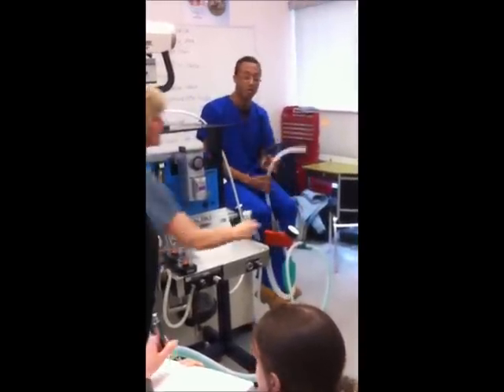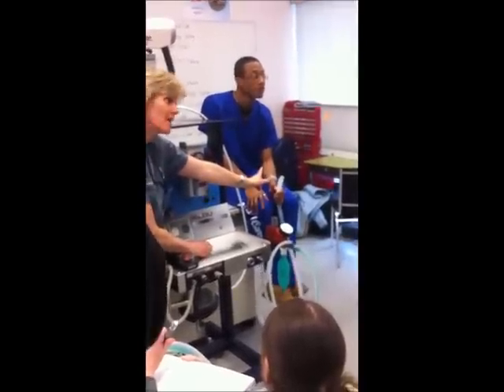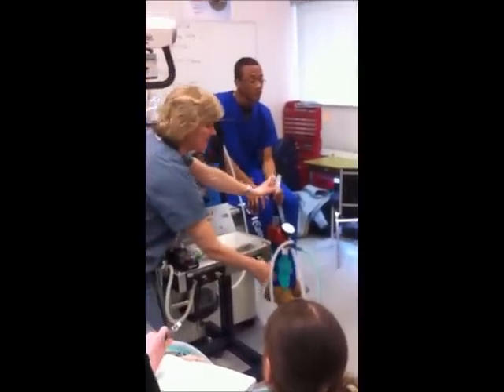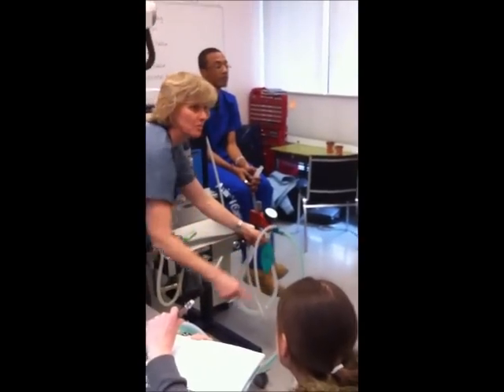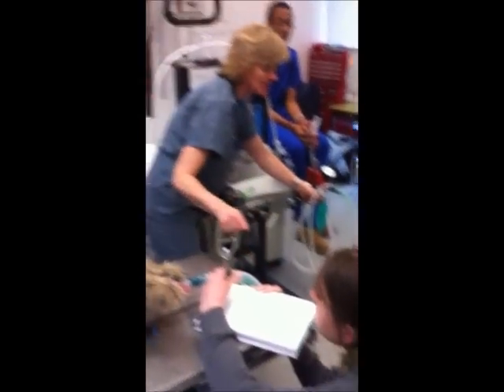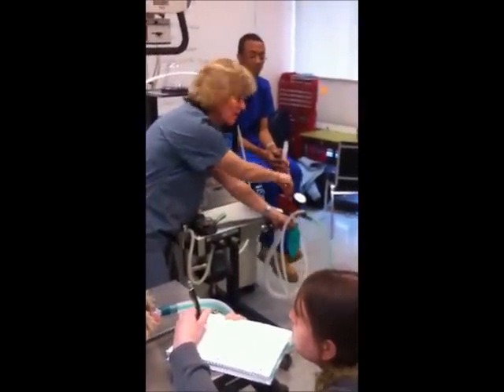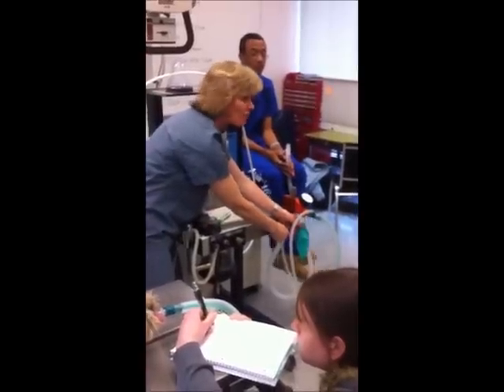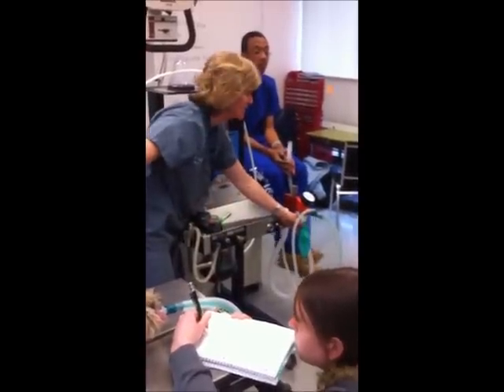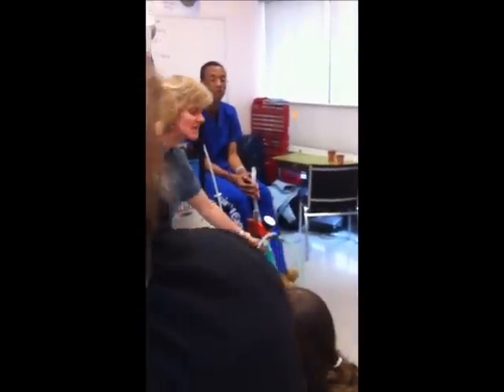Yeah, so if we've stopped flow going that way, I get my bag filling up, and really I would over time get pressure building up in my system here. I don't want that to happen. That's why we bag. It's active. So I close my pop-off valve. This will fill. Now at this point in time, it's filling with oxygen. I don't want anesthetic gas going into this animal's lungs at this point in time. But I basically am forcing oxygen into there.